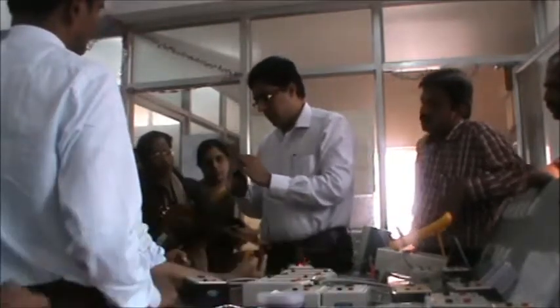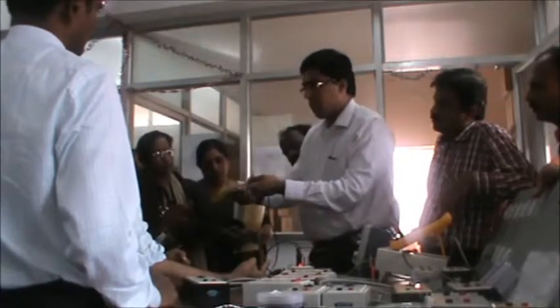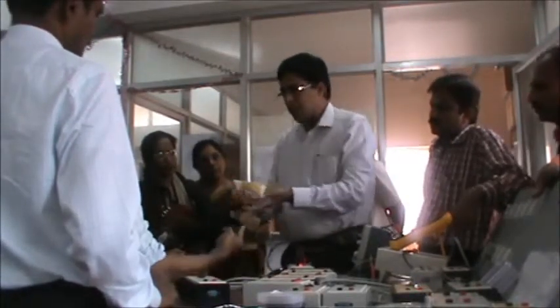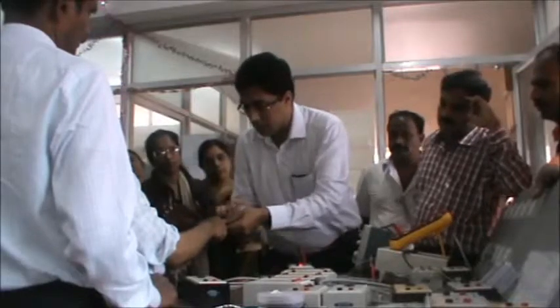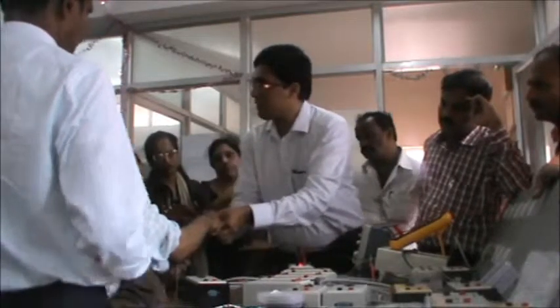So if you see, this is basically finger plethysmography. Pulse can be obtained from the periphery of the body. It could be fingers, it could be earlobes or toes, at the extreme ends basically. So this is not a pulse oximeter. This is finger plethysmography. A pulse oximeter is different, wherein we obtain the oxygen saturation.